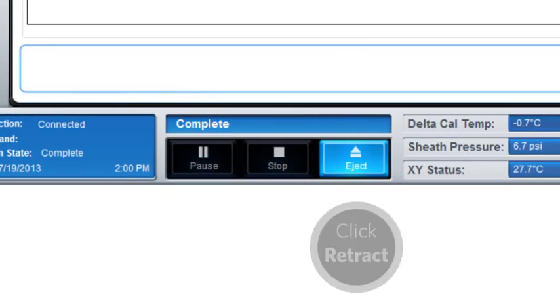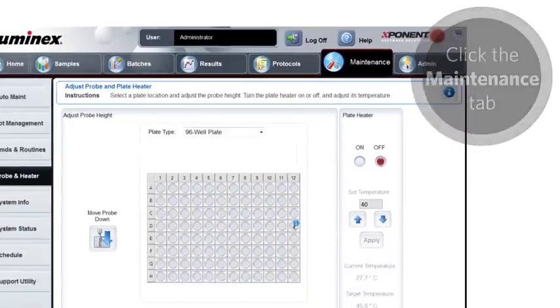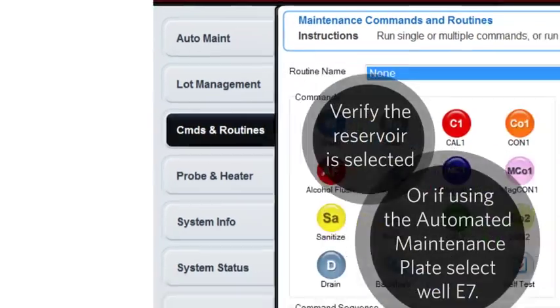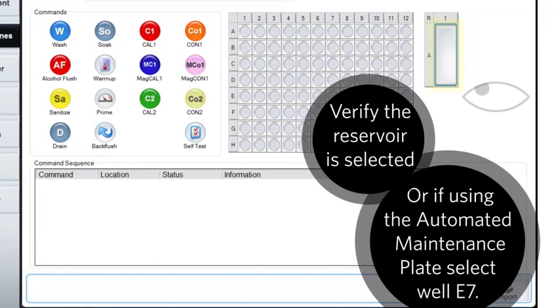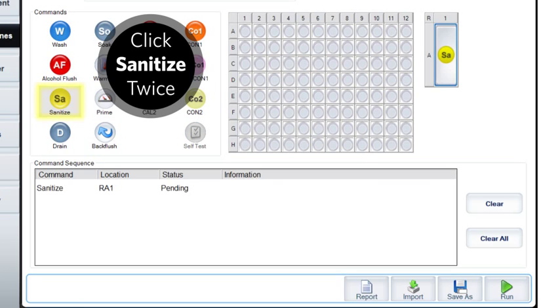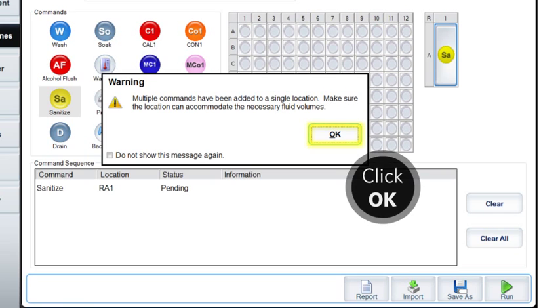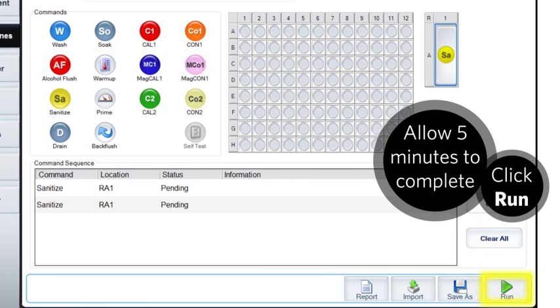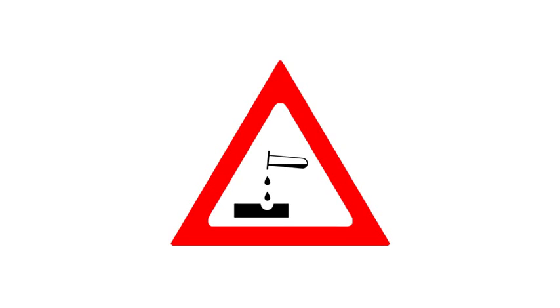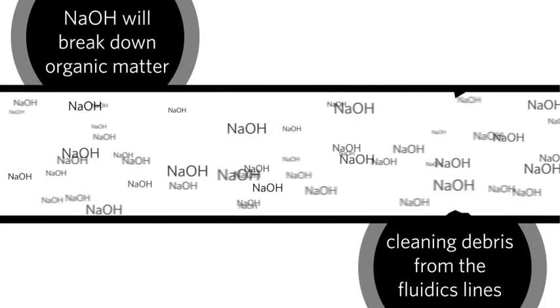Click on the maintenance tab. In the routine section, verify the reservoir is selected on the plate layout. Click on Sanitize twice. Click OK. Click Run. Click OK. Because of its caustic nature, sodium hydroxide will break down organic matter, helping to clean out any debris in the fluidics lines.